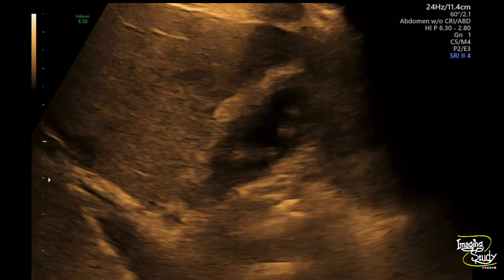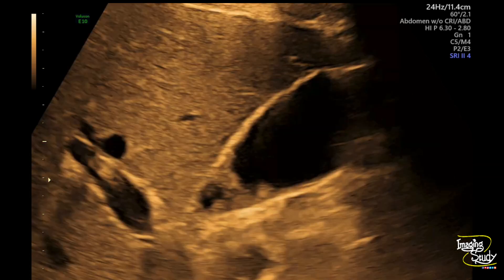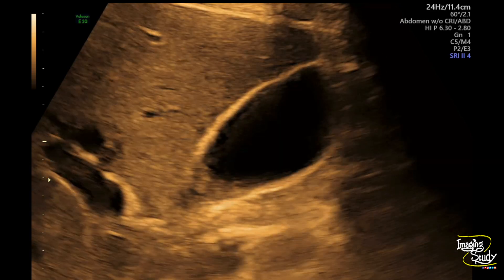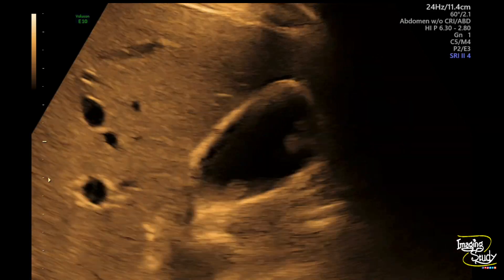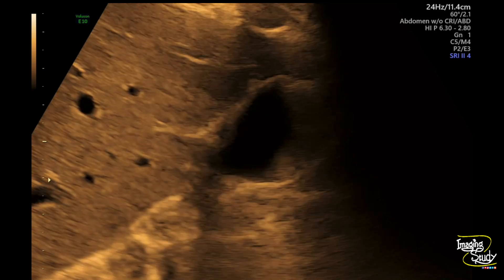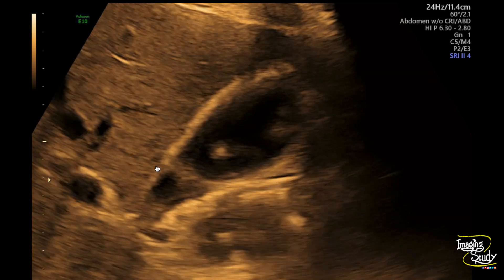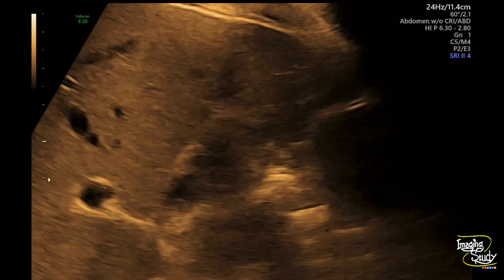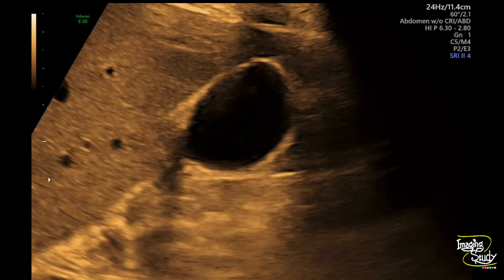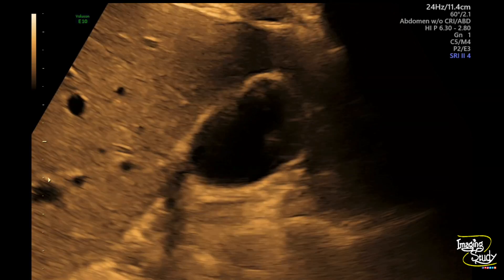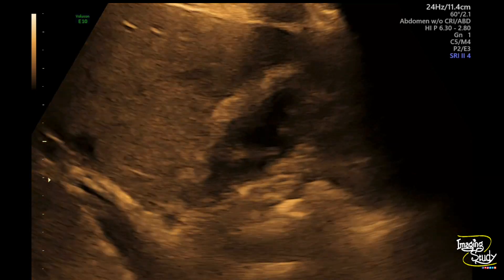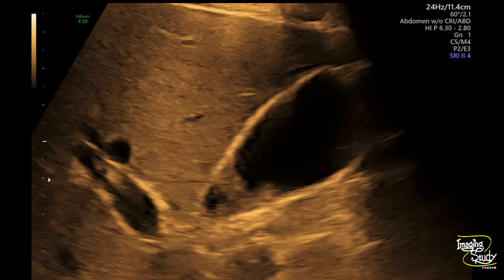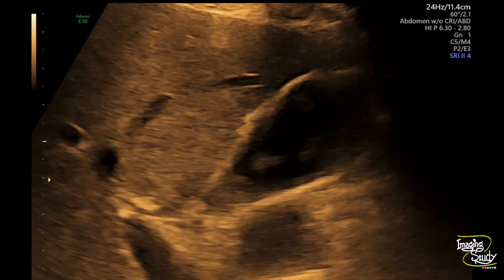The common differentials here are gallbladder polyps and soft calculi. If they move with posture changing, then we'll go for soft calculi. Though we can see they are attached to the gallbladder wall, we should definitely check them with posture changing. Even sometimes you may see multiple polyps and one or two of them may be calculi. So be careful — whenever you see any polyp, don't forget to search for calculi.